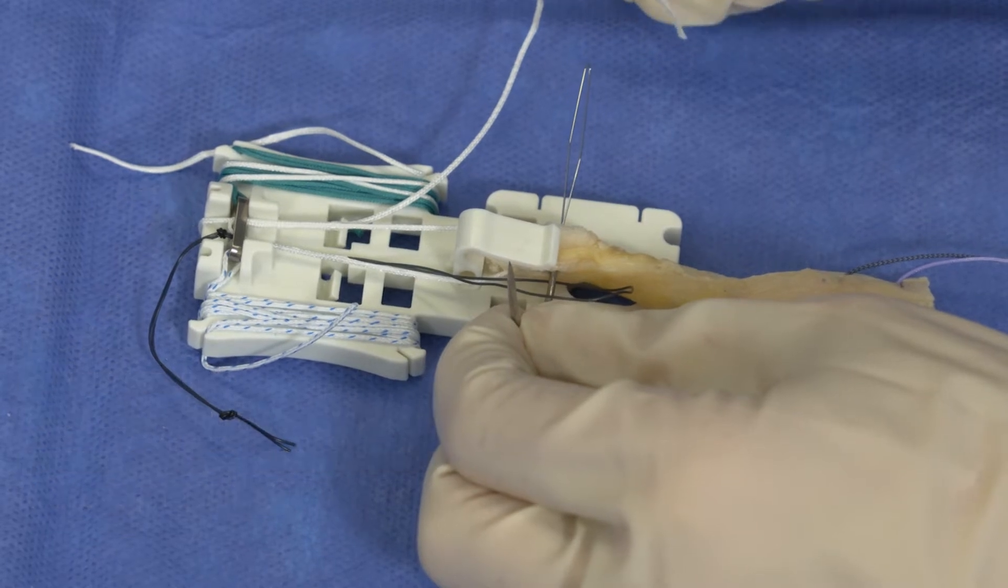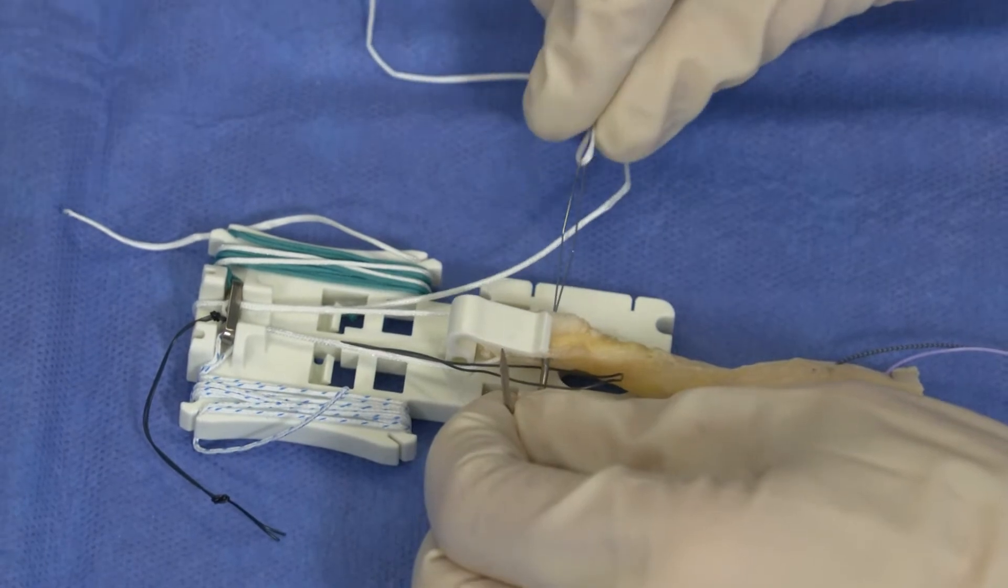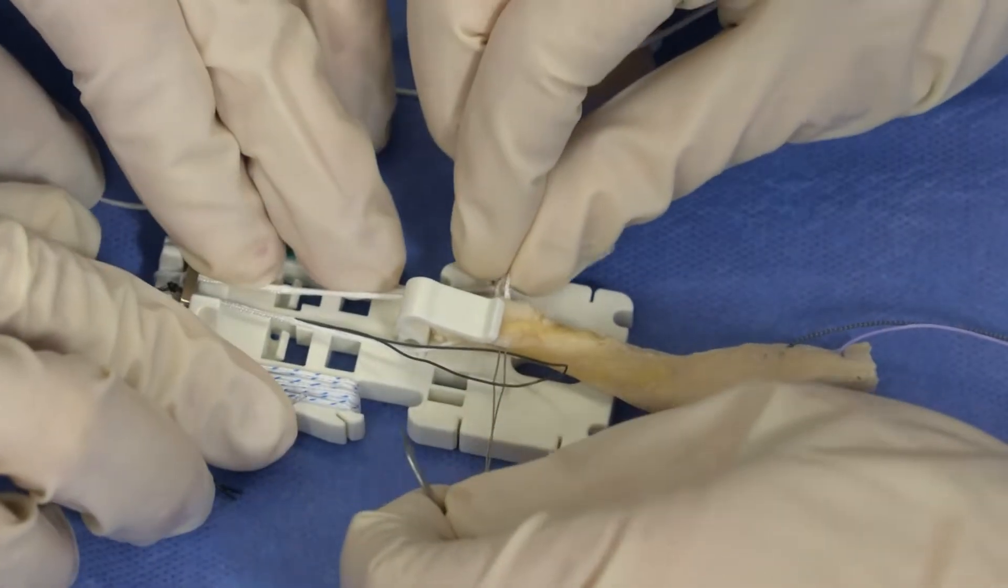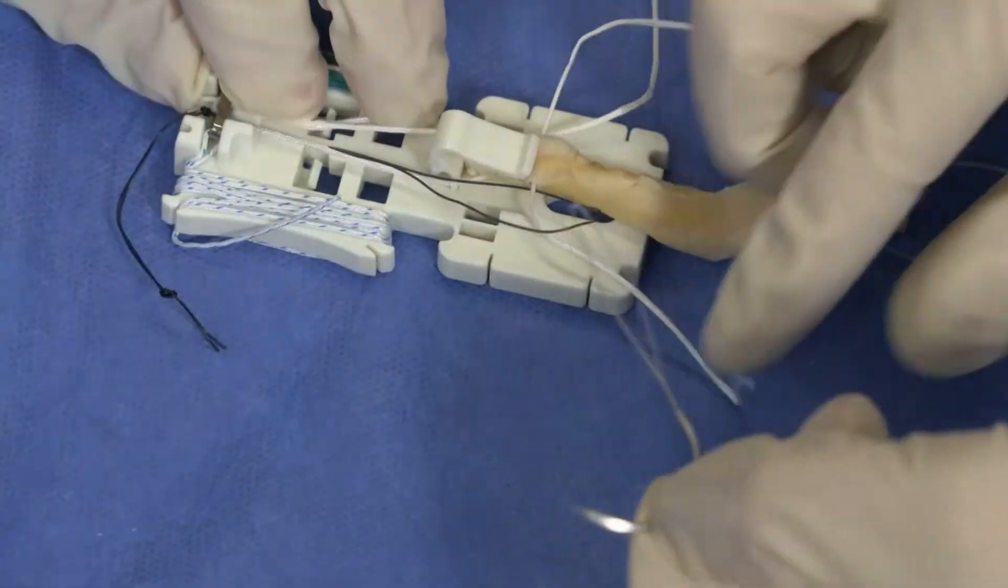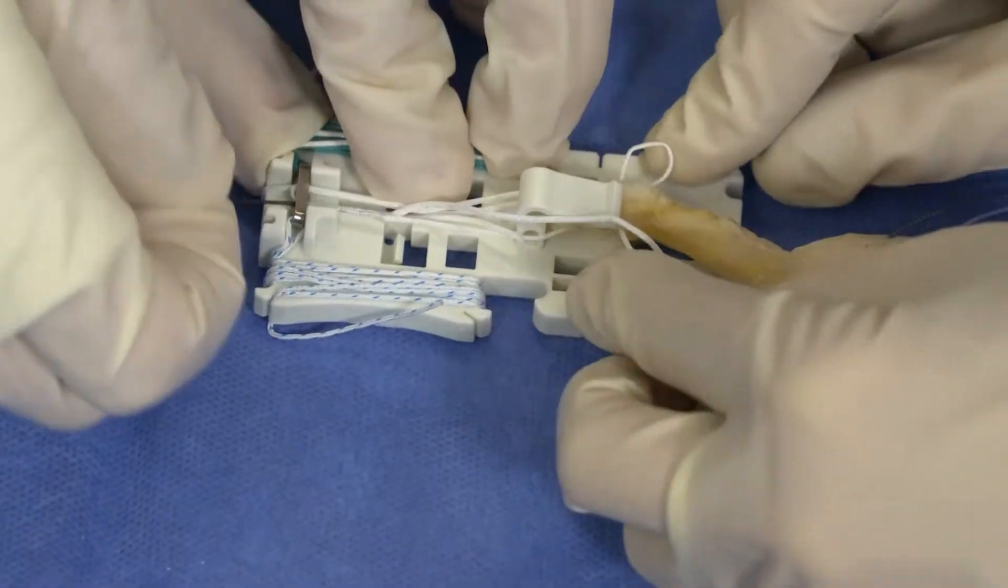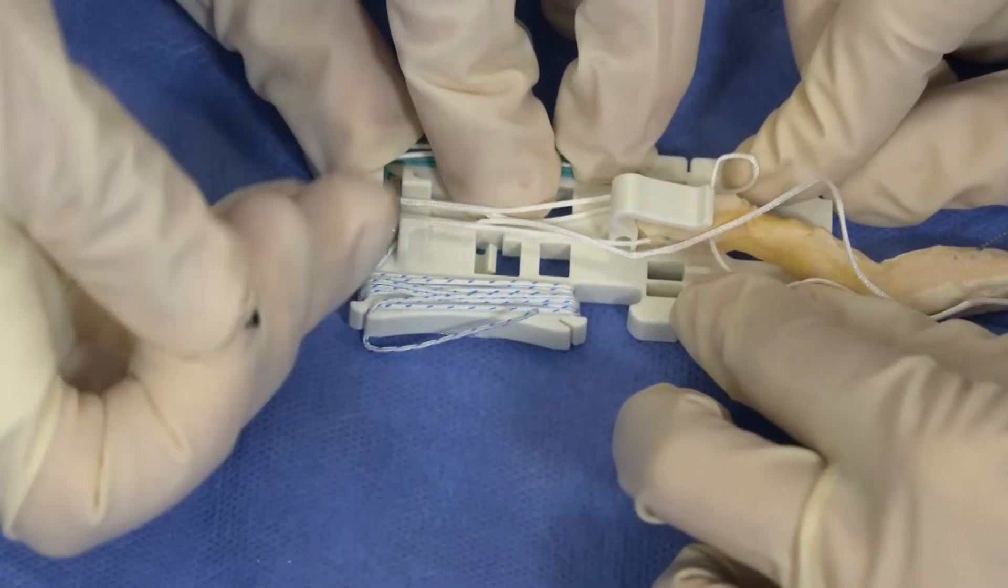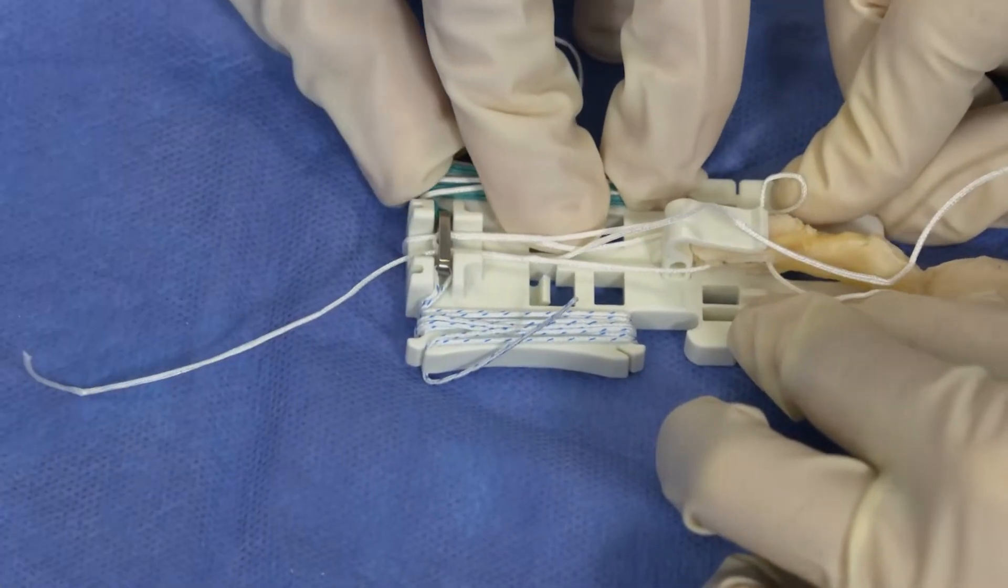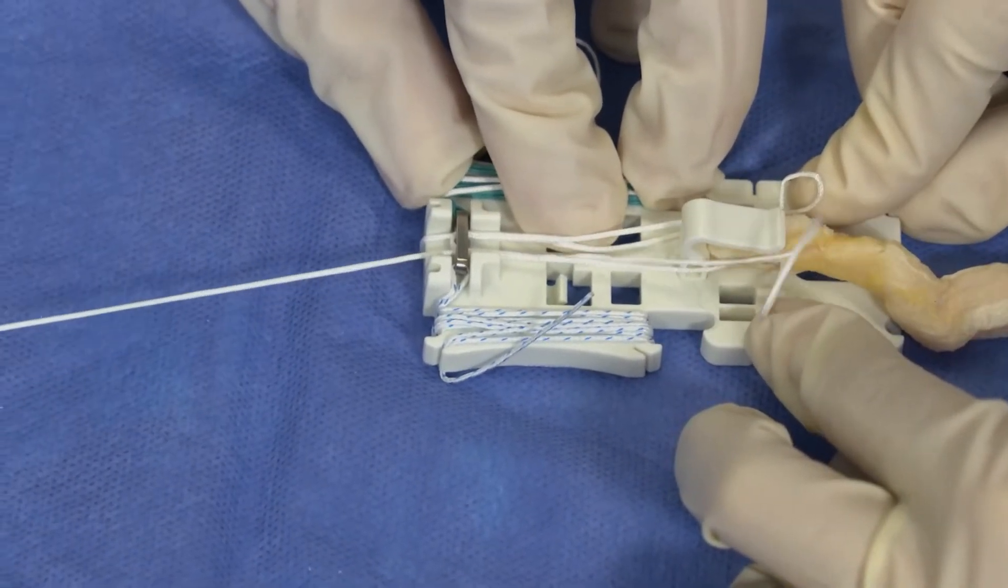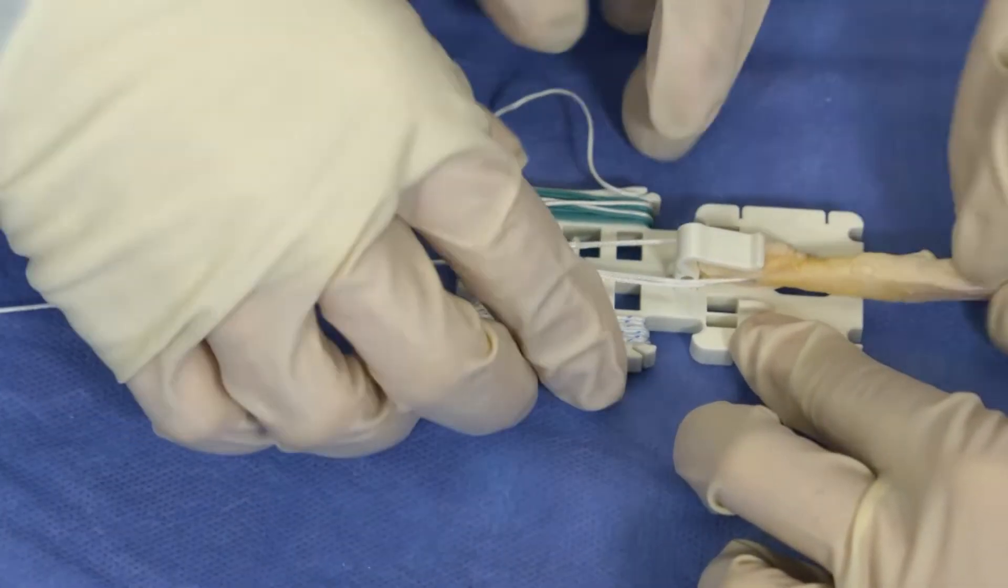Next I'm going to be passing the second tensioning suture through the kite with a needle through the distal hole and through the black relay loop to feed the suture through the button. This is done through lateral movement side to side in line with the base to feed the suture through the button, and at this point your graft is attached to the button and the construct is together here.